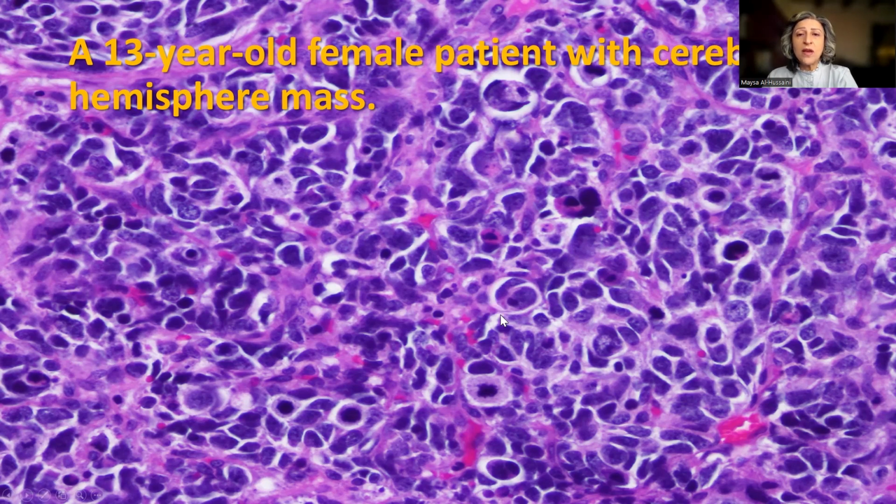What are the features of anaplasia? We have cell-to-cell wrapping here, and here we have enlarged cell size. And remember, for the large cell in medulloblastoma, we have to look for a reference, and our reference would be a red blood cell, and the tumor cell should be 3 times or more than the size of a red blood cell. And as you can see here, for example, it's at least 5 times the size of the red blood cell, more or the same here, really large, ugly cells, as well as a large number of mitotic figures that are easily identified. And then we see apoptosis.